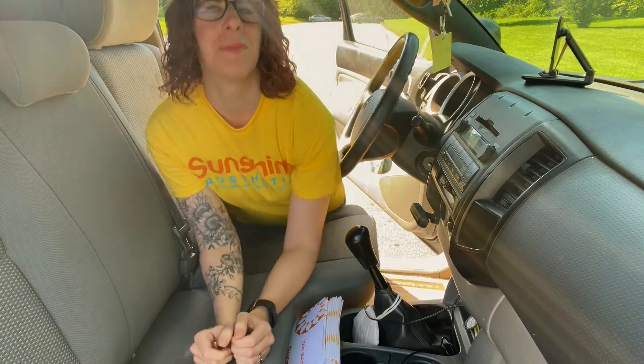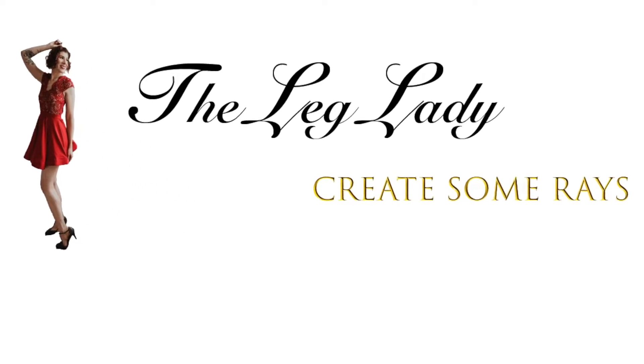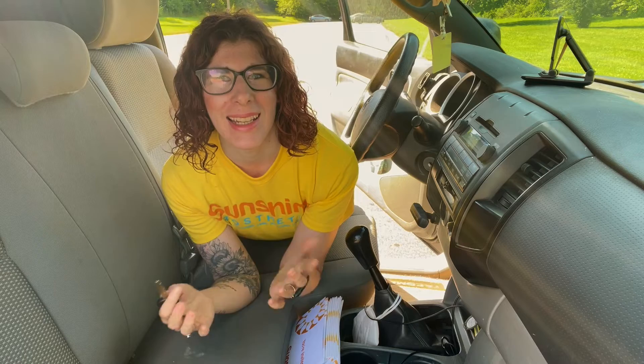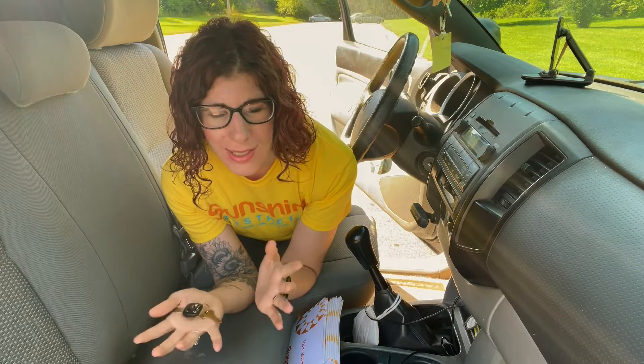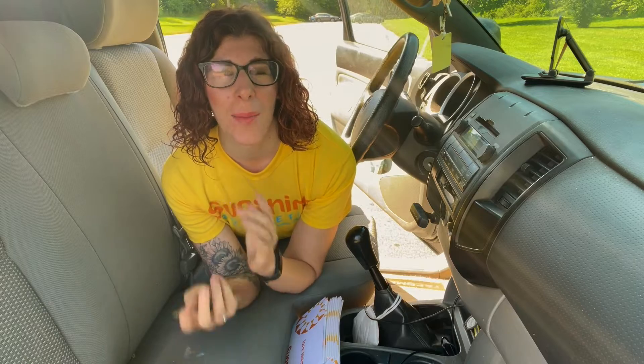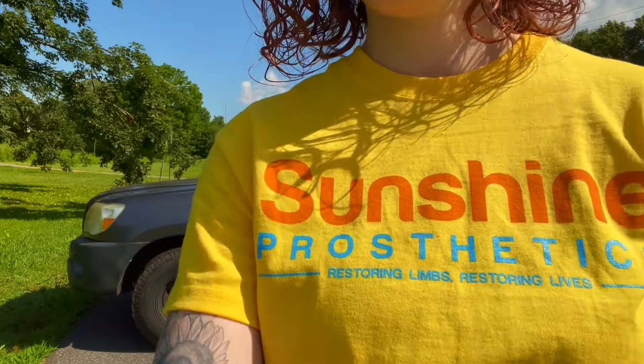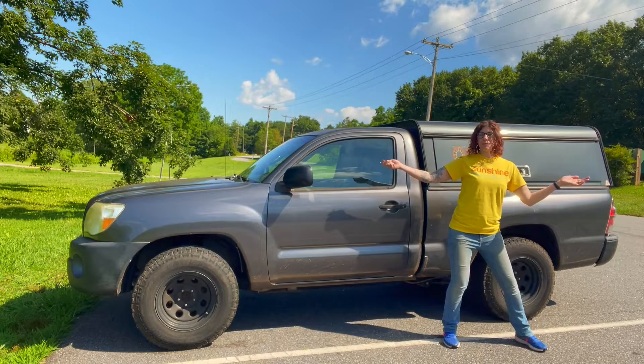Hey guys! Christine Hill with Sunshine Prosthetics, or as most of my patients like to call me, the lake lady. I am an American board certified prosthetist orthotist, I make prosthetic legs, and I care for amputees. Welcome to my office.